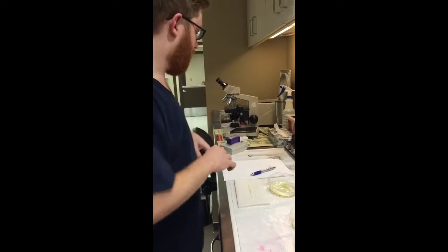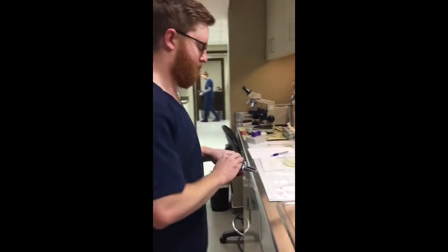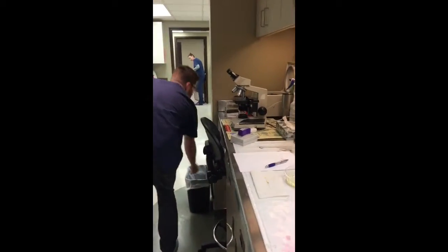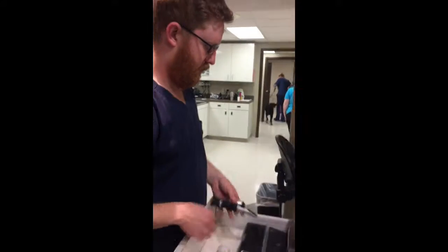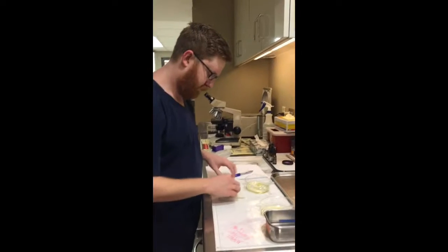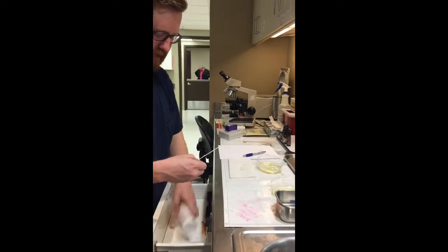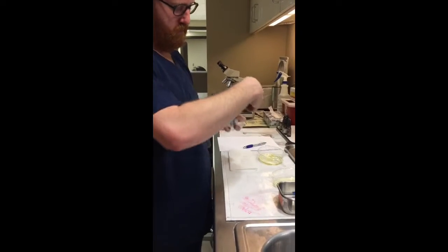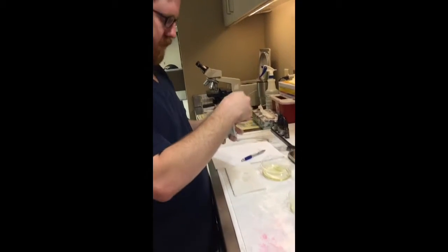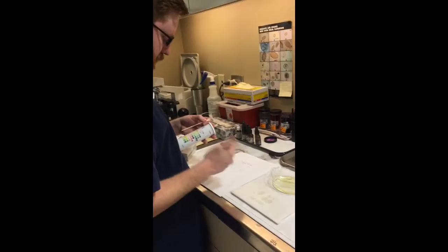While I do that, I can clean my refractometer off using just a little bit of water. And I'll set that back here and allow it to air dry. Get the excess off here, and we can compare it to the container and make a note of anything abnormal.